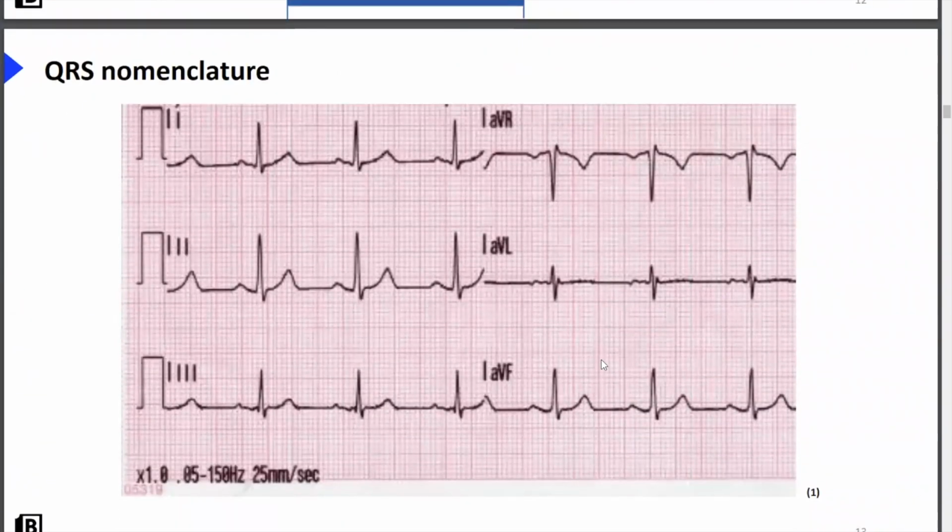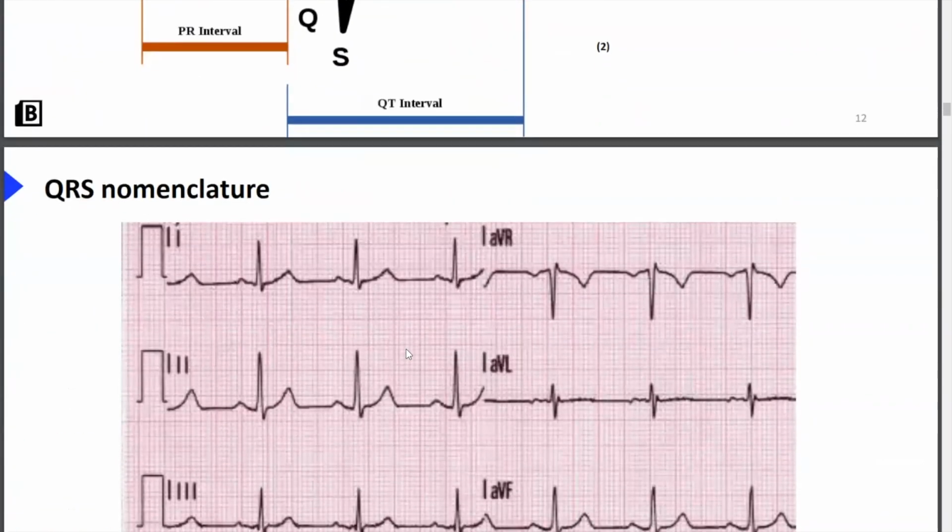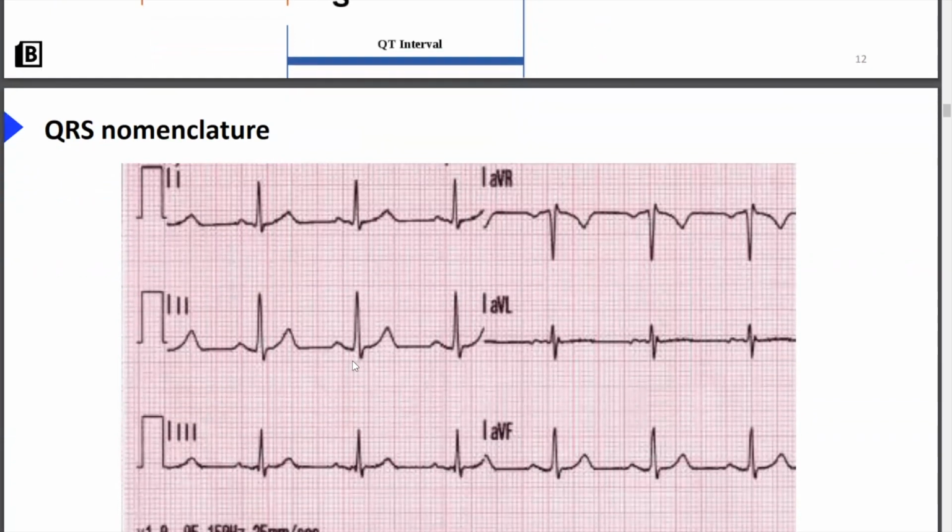Fine. So one thing which really confused me, we now know the ECG morphology, but the QRS used to really confuse me at medical school. So I put a slide here, and it looks different in every lead. It looks different in 1 to AVR to AVL, and this gets really confusing because you don't know if that's normal or abnormal. And no one actually ever told me this until I went and read up on it myself, but how you actually name the QRS complex and what looks normal and what looks abnormal.